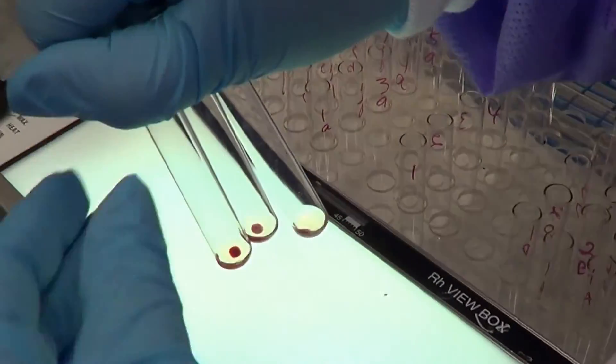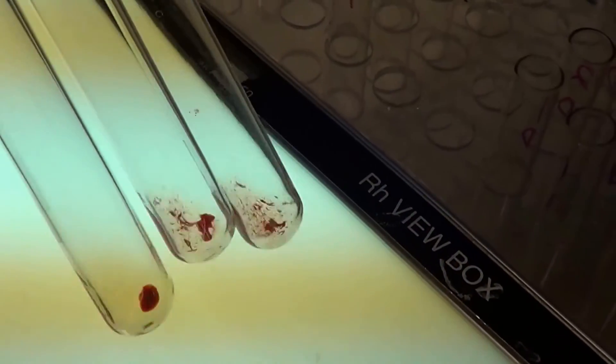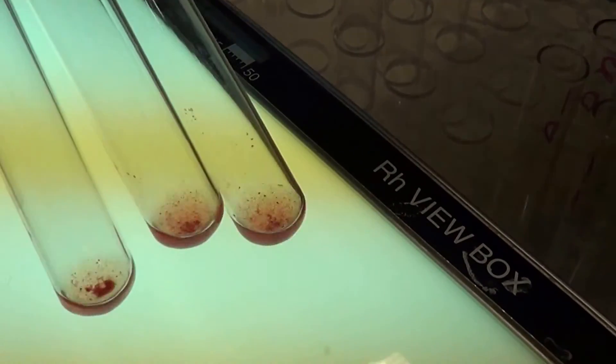You again shake them and check for agglutination. This time you want to have a positive agglutination. This means that your negative anti-human globulin test was valid.